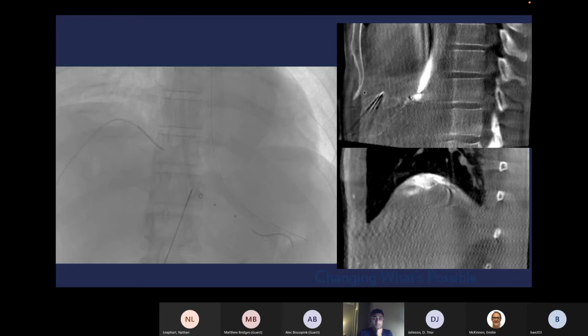of spin CT. That's what that picture you're seeing is, what's called a spin CT, which is a fancy thing we can do to get a low quality CT with fluoroscopy. And then if you see all the bright stuff in the bottom picture, that's actually a mixture of saline and contrast that I infused on top of the liver to move the lesion away from the heart, so that I wouldn't burn the heart. That's called hydrodissection.